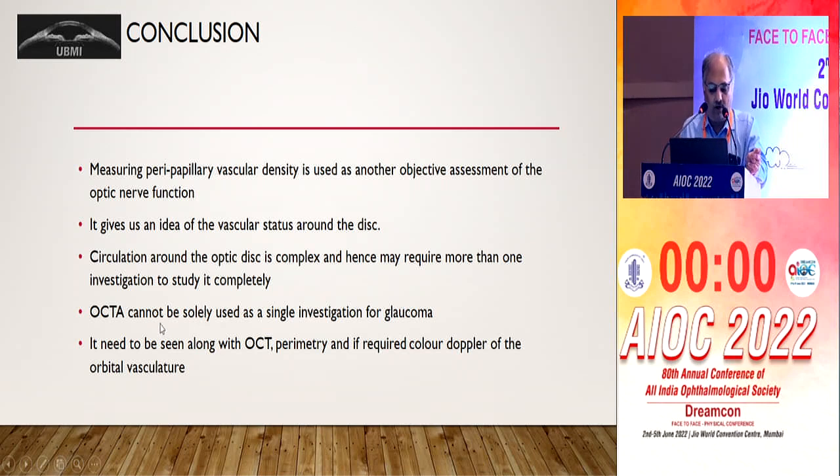So OCTA cannot be used solely as a single investigation. It has to be used in combination. So we are adding now OCT, perimetry, OCTA, and color Doppler to the system.